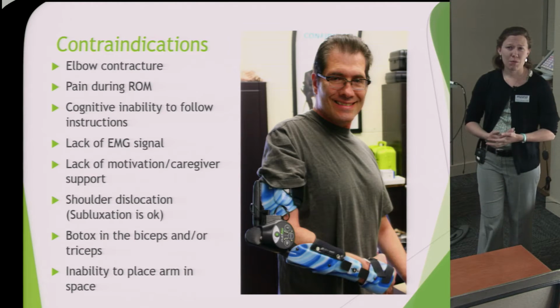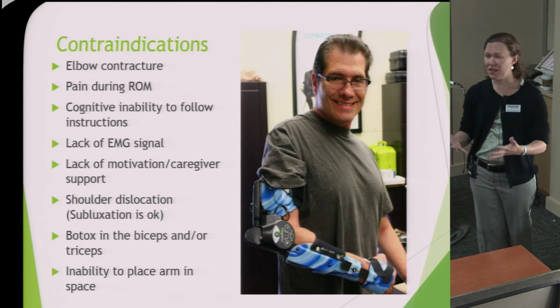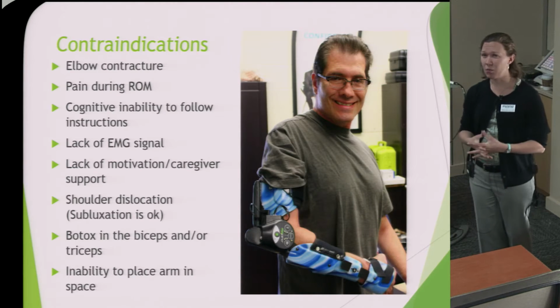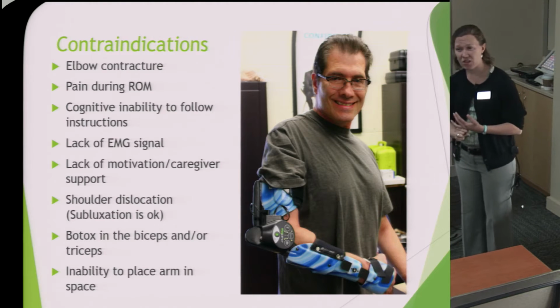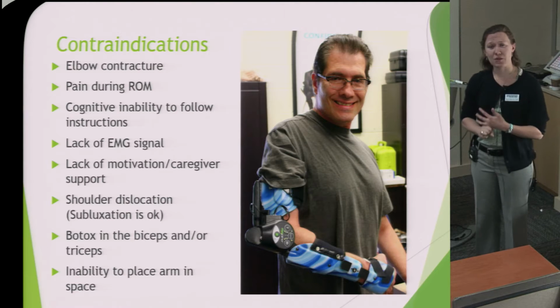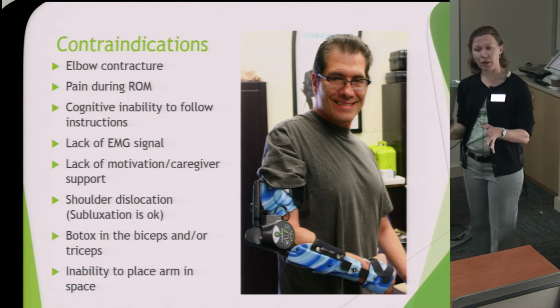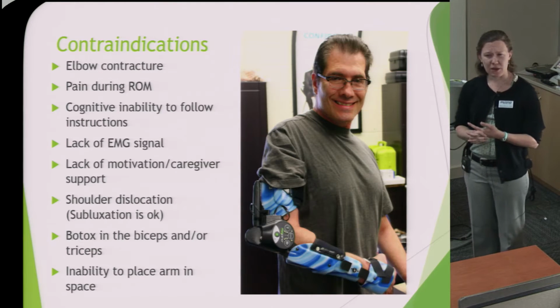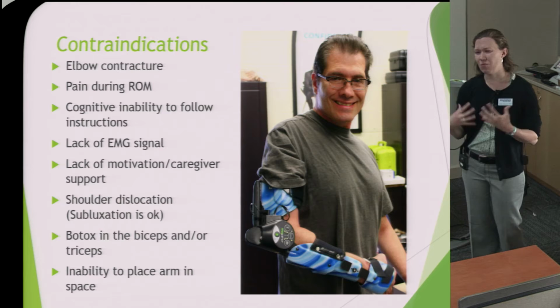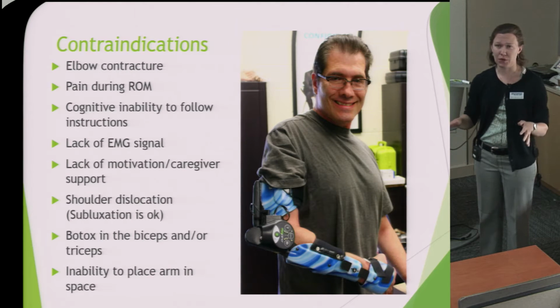If the caregiver's not motivated, if the patient's not motivated, if there's no support, as with anything, that's generally not an appropriate patient. If they have a current or chronic shoulder dislocation, due to the weight of the orthosis, we do recommend not fitting those patients. Subluxation we can work with. We can handle that okay with a harness. But if they do have that full dislocation, 2.5 pounds added to that is not an ideal situation. So we try to avoid those patients.